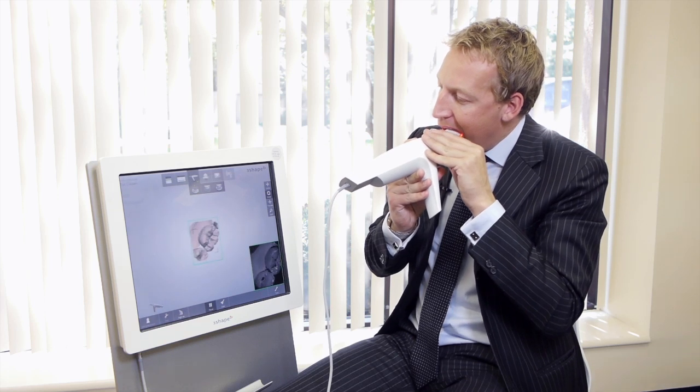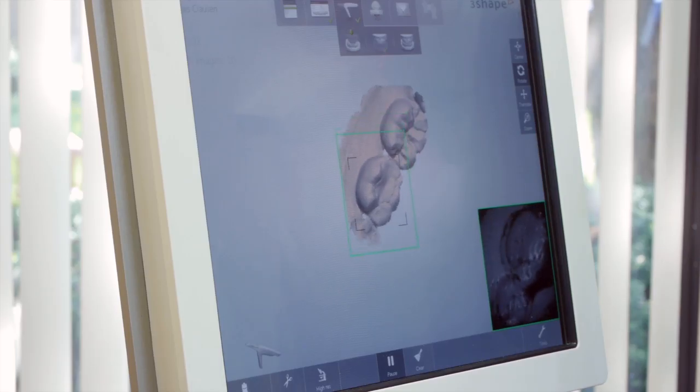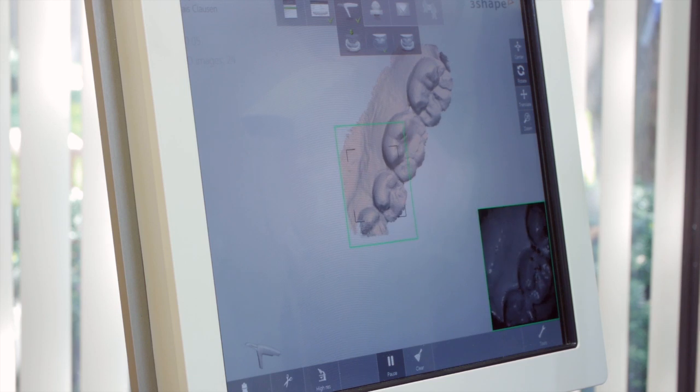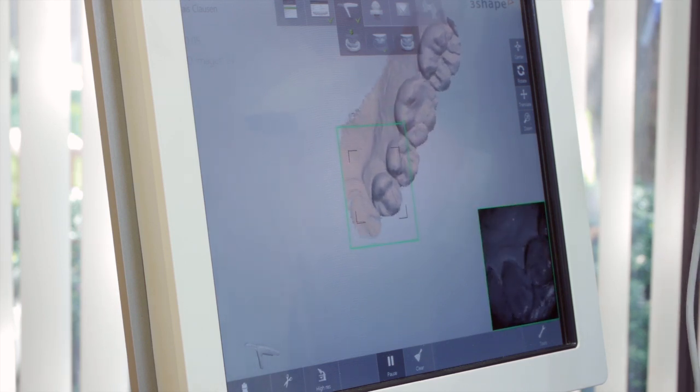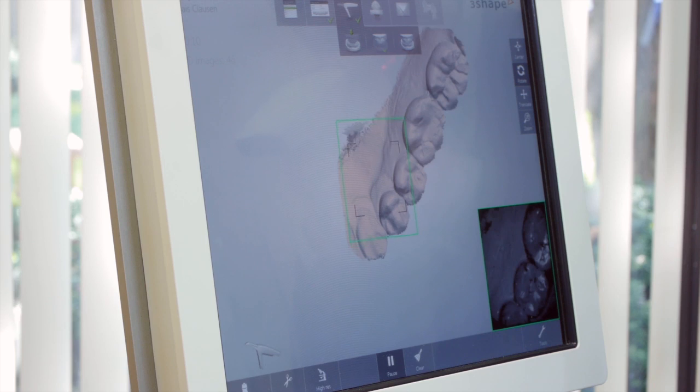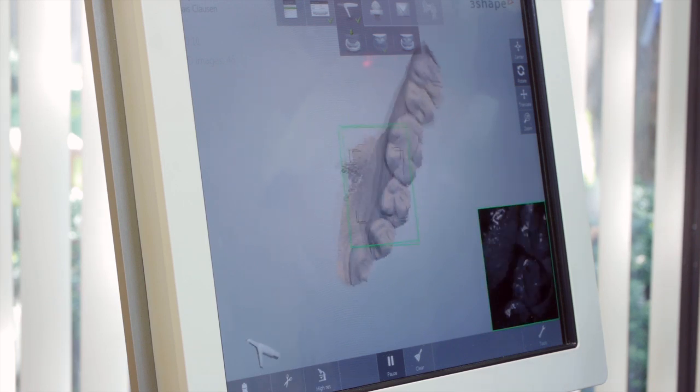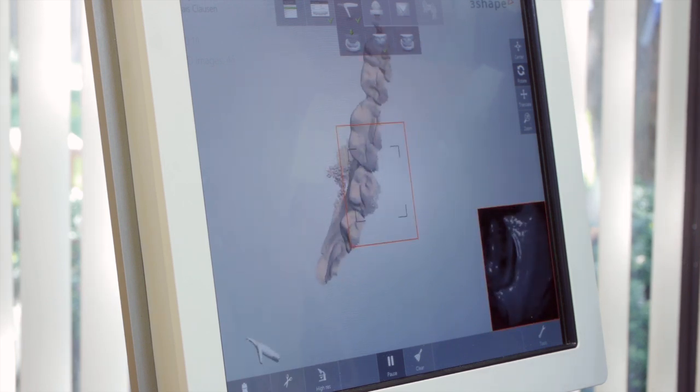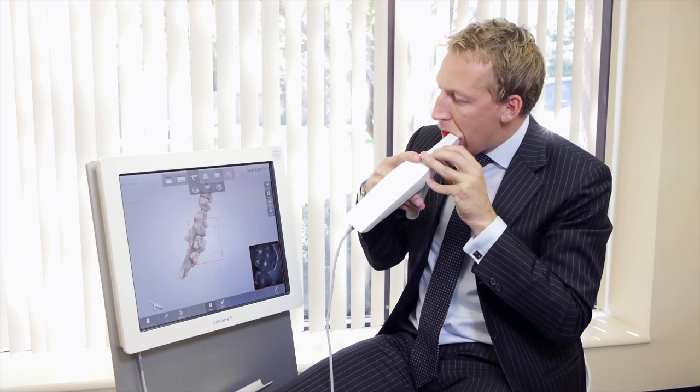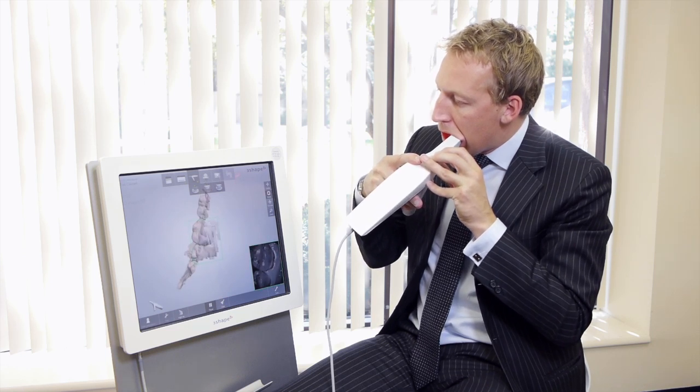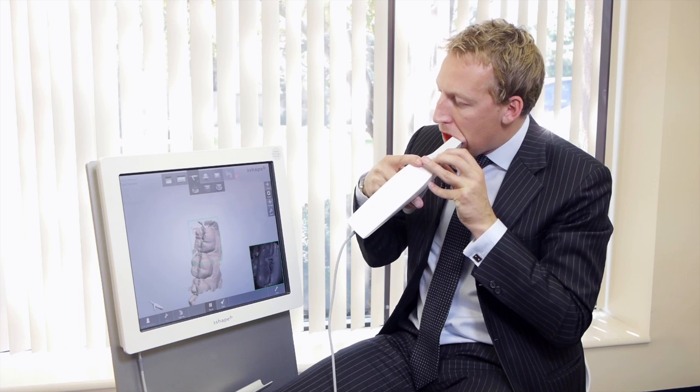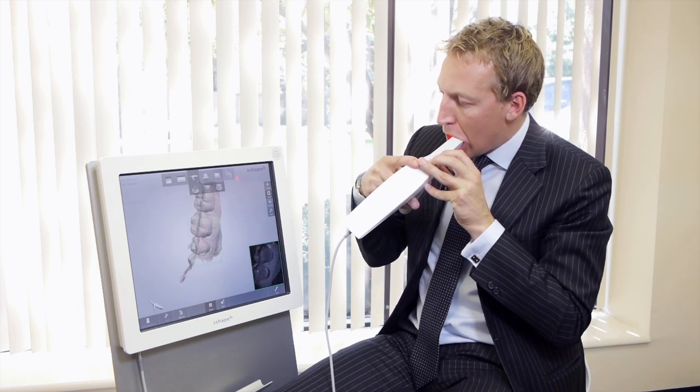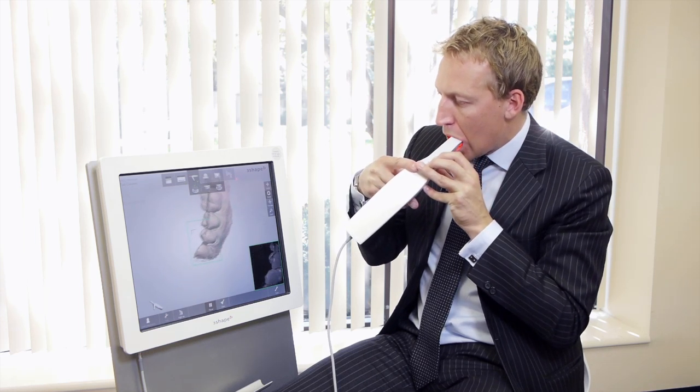So now I'm moving to the upper jaw. I want to take a quick look.